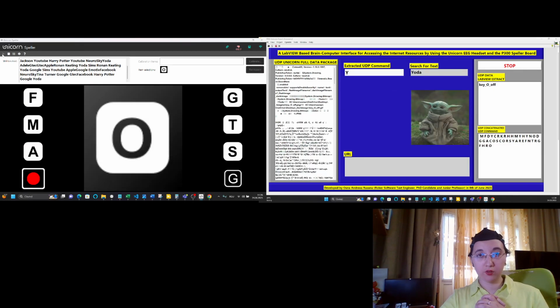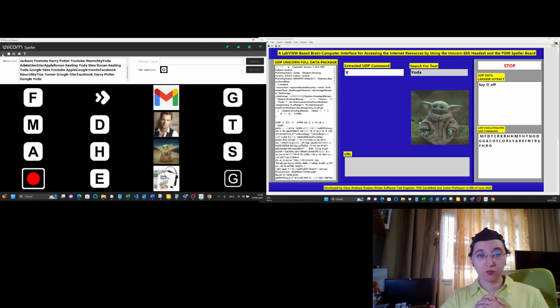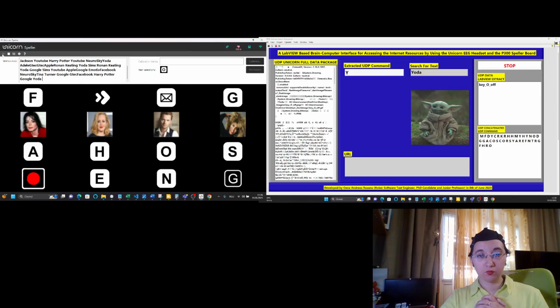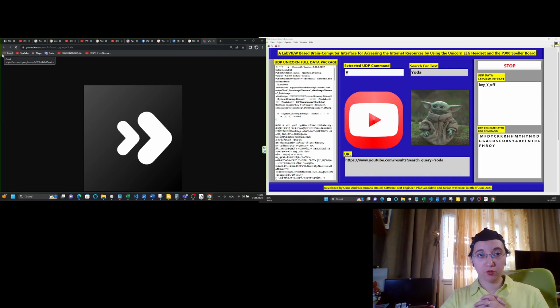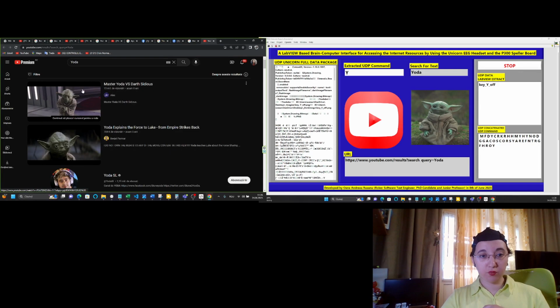So Yoda was selected, and now YouTube. YouTube was selected. Now Google is opening the YouTube web page and is searching for Yoda.